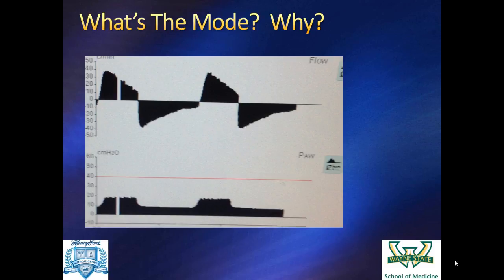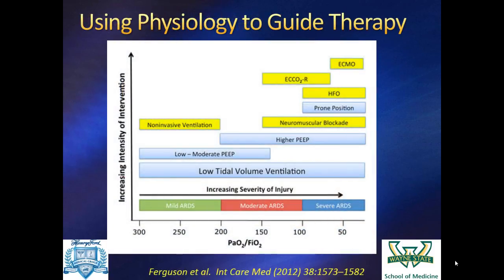Thank you, Dr. Ouellette. So, pressure control, we set an inspiratory time. You don't set an inspiratory time with pressure support because it's flow cycled, not time cycled. Right? So the only way you could tell with 2 breaths is if I gave you 20 breaths and you saw 20 and they're all the same duration, you go, that's probably pressure control. If they're different duration, there's no question it's pressure support. The other way you know is if you have breaths that aren't triggered, which is, I agree with you, when I only show you 2, there's not a lot I can show you to know that it's not pressure support, but good. All right.